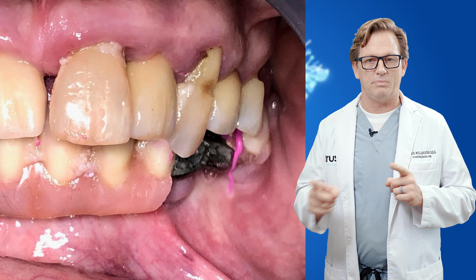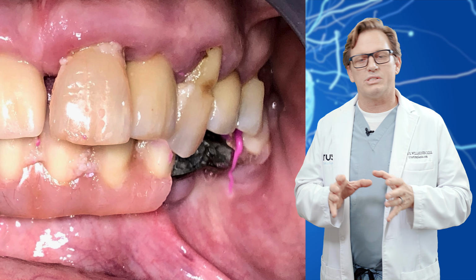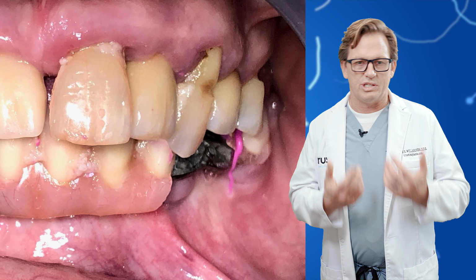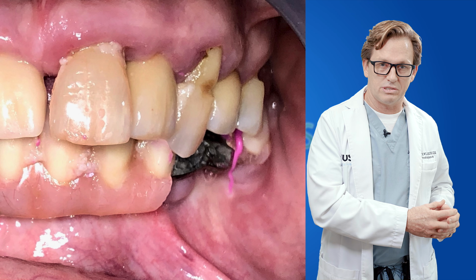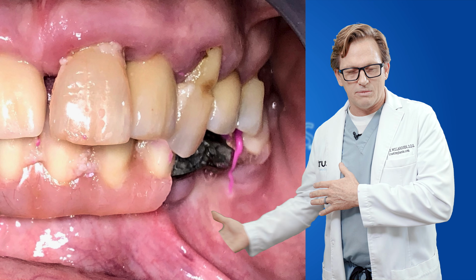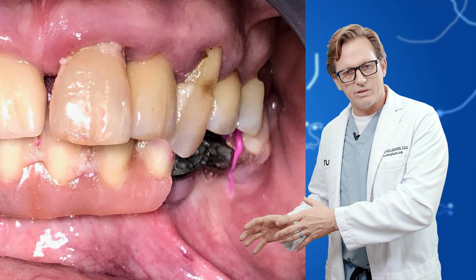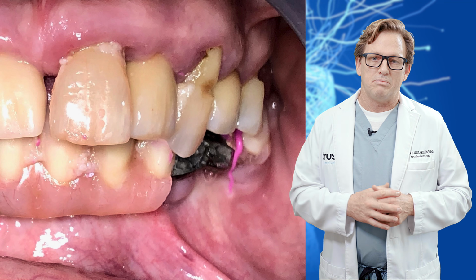So here's another patient who, same thing, had lots of implants, different implants from different manufacturers, different doctors, and she was always directed by her general dentist, who would send her to a surgeon. He would place a certain type of implant. A few years later, they would do another extraction, graft, implant, and then this guy would place another brand or type of implant, and then ultimately she ended up in my office.